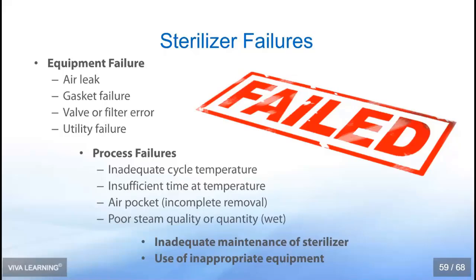An Instapot that's a steam cooker is not a sterilizer. Remember, sterilizers are considered by the FDA to be a type 2 medical device, and they have been tested to perform as such. So a Black & Decker toaster oven does not constitute a dry heat sterilizer.